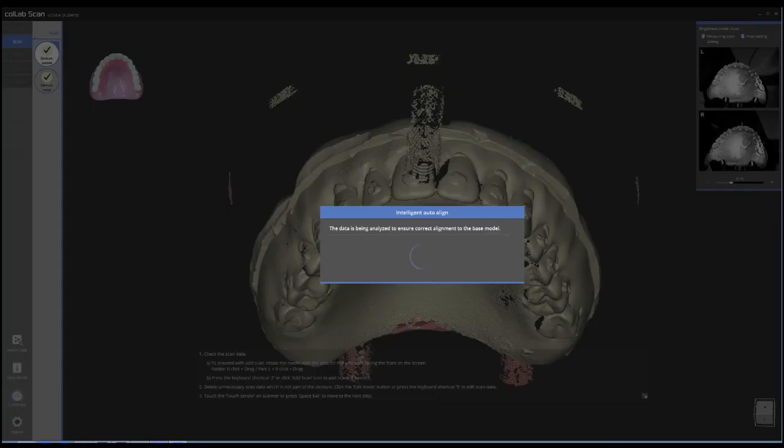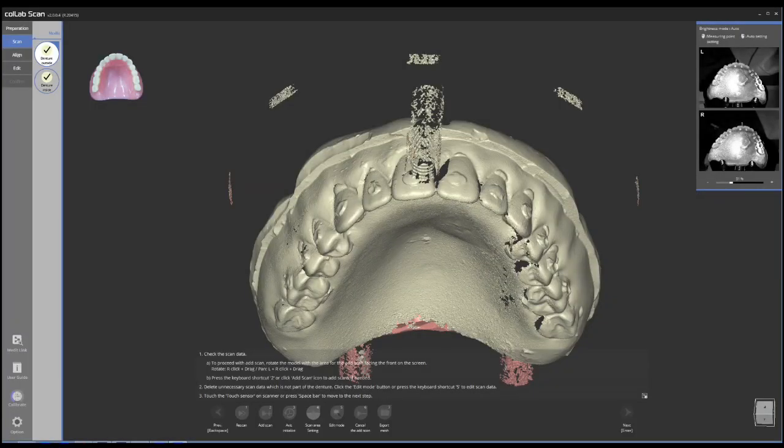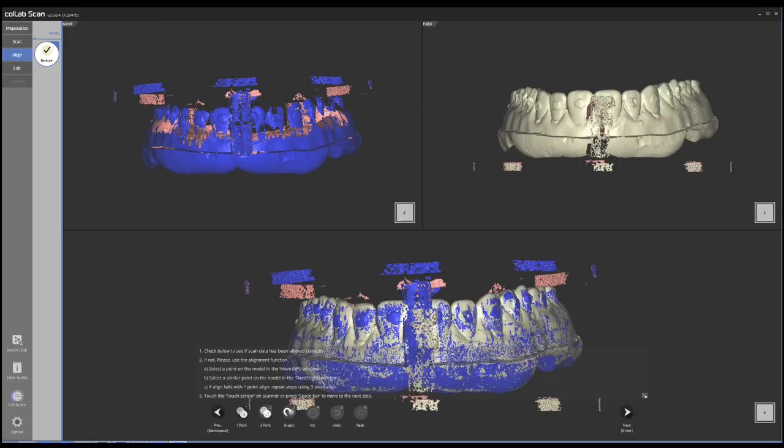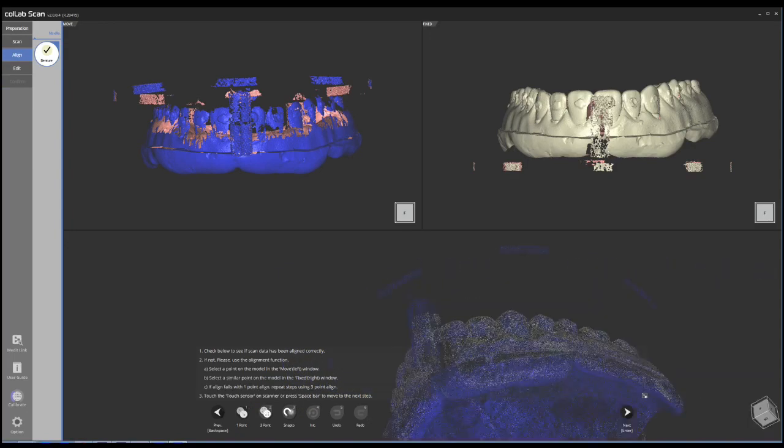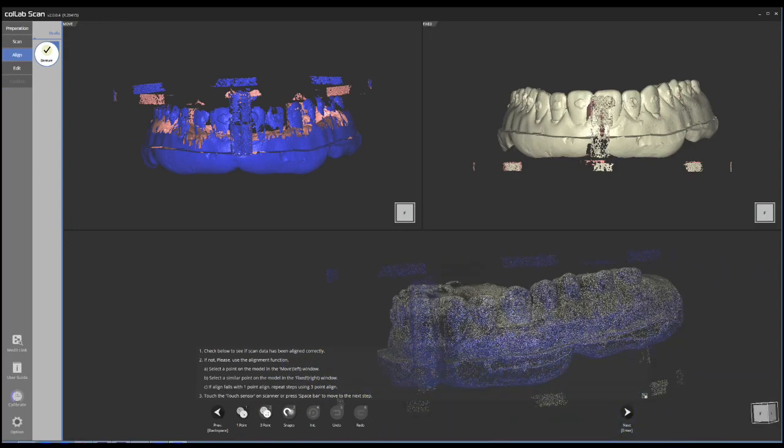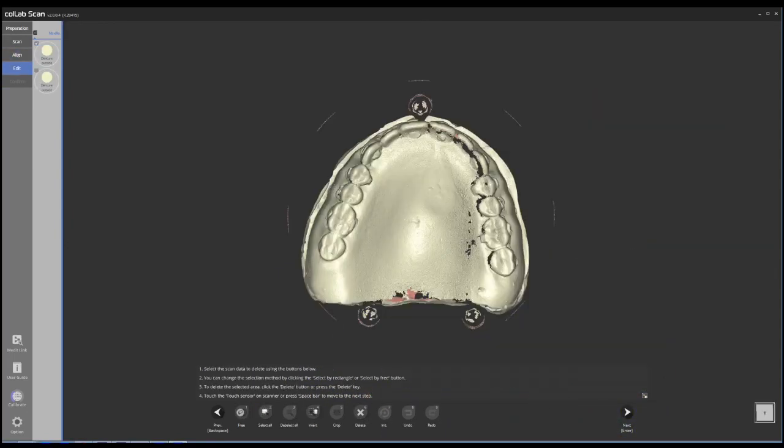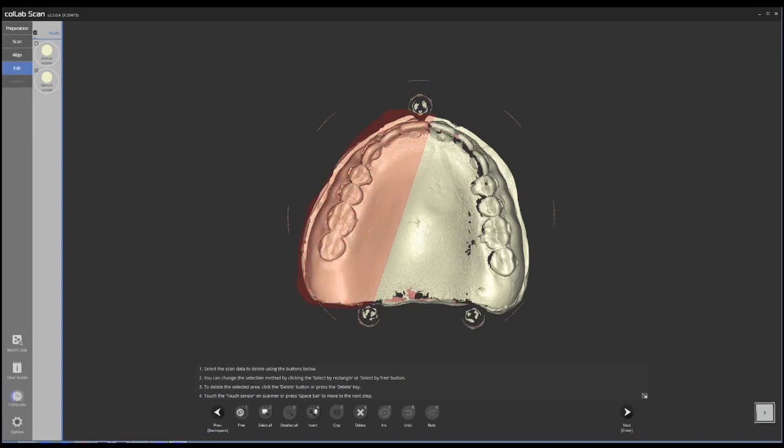For the most part, the scanner does a really good job aligning things. You can also choose points if you have to. In this case, I'm going to proceed because everything is perfectly aligned. You're going to end up with some scatter from parts of the scanner that are very close to the denture.